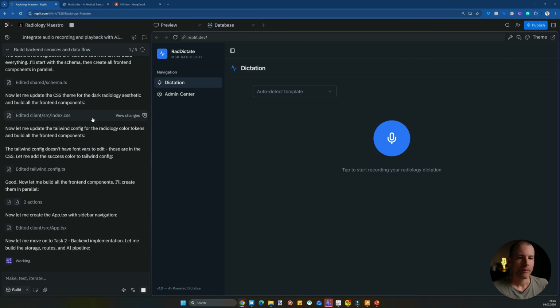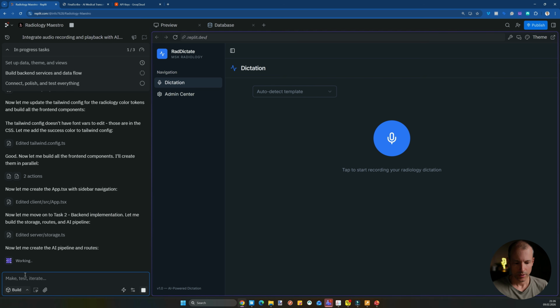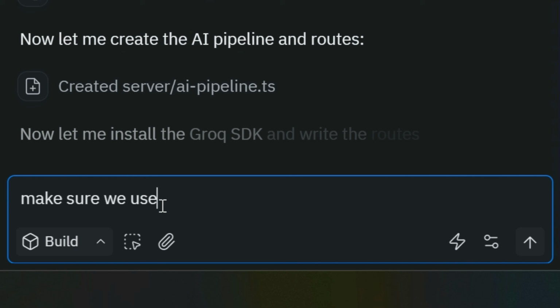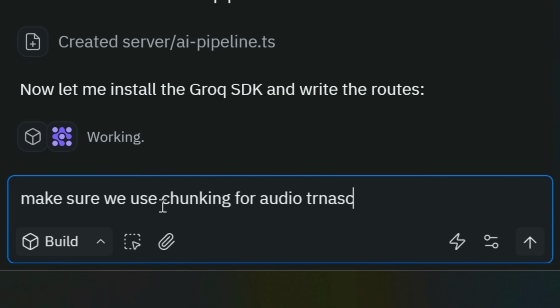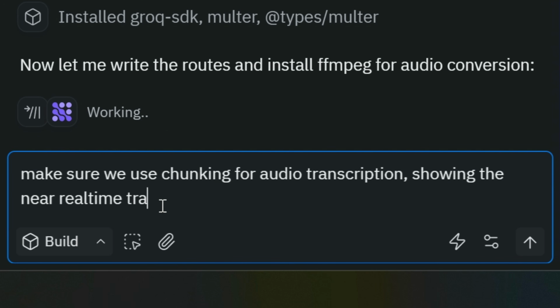Okay, guys, so we now have a first view of how this will look. We can see the progress here, 1 of 3 tasks: setup, data, theme, and views, backend services, data flow, connect, polish, and test everything. So I want to tell it, make sure we use, I'm going to get the proper term, because of the chunking, we use chunking for audio transcription, showing the near real-time transcripts below the record button.